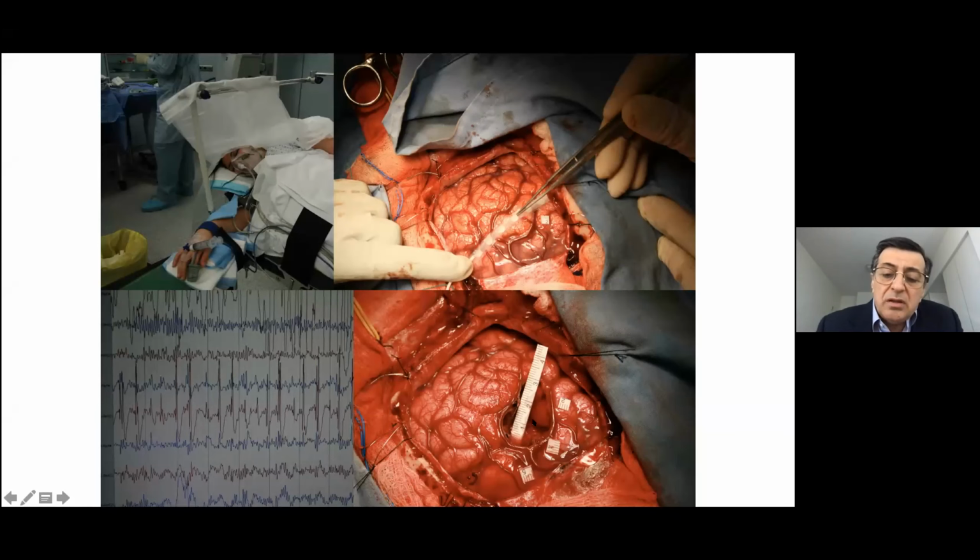And of note here is that when we use subdural electrodes, coming back and doing another surgery is very complicated, I find. It's not easy to redo surgery after the insertion of a subdural electrode, particularly in eloquent brain. And so that's why we proceeded with the surgery.